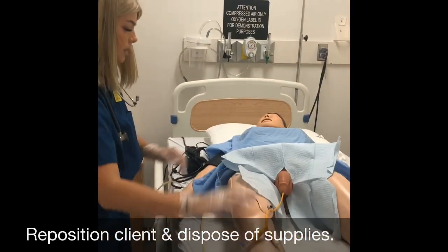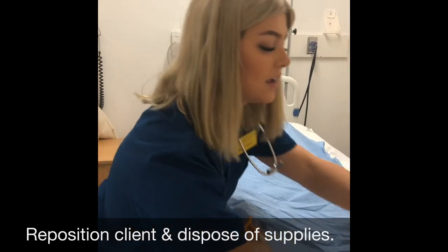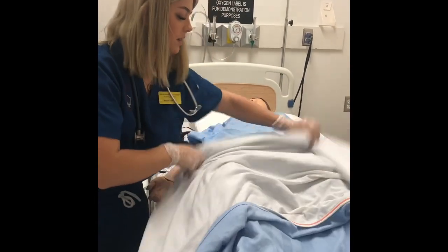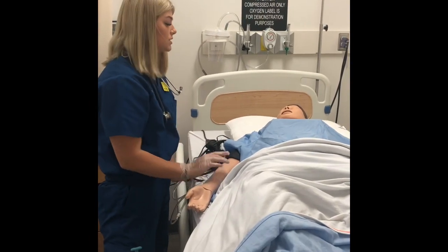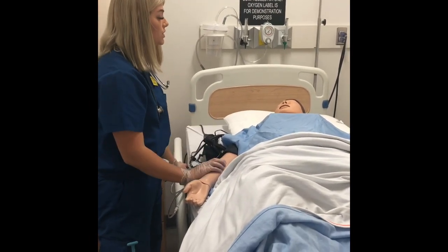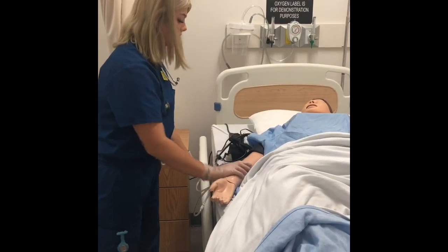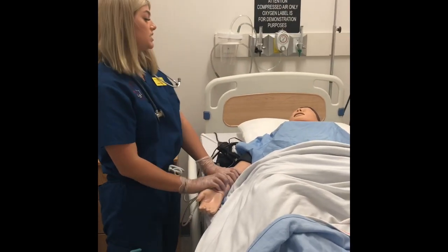And that way when you disconnect the bag, you don't have blood coming out. Mr. Mancini, your catheter is inserted. So this is your means of going to the washroom now, so you don't have to get up and go to the washroom. This will eliminate your urine from here. And here is your call bell. If you have any problems, please feel free to call me.